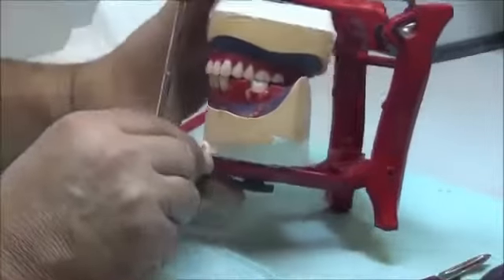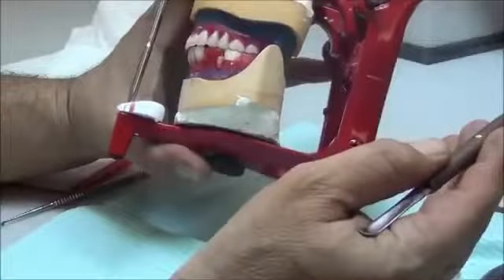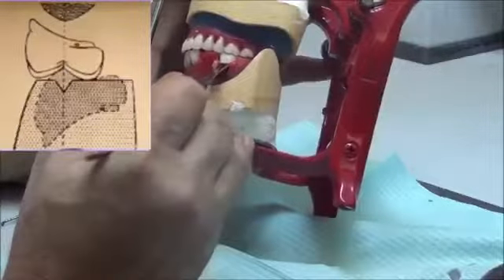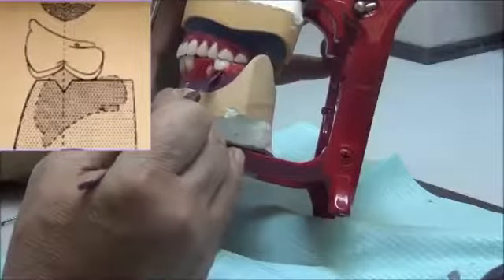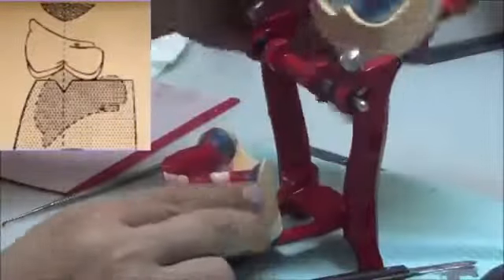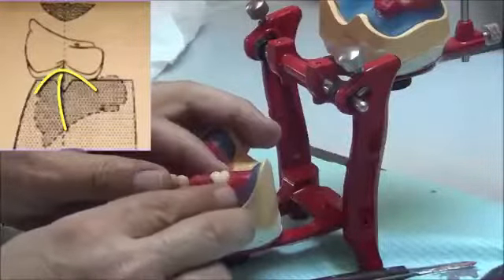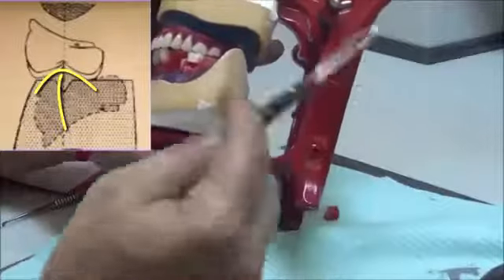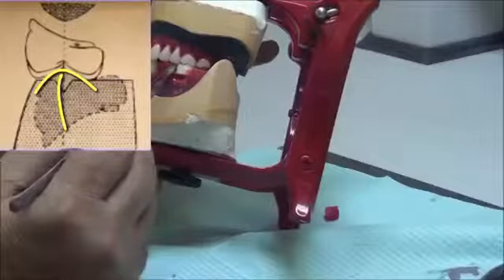We also want to point out that once you're working with the upper and then go to the lower, make sure your wax is totally cold. So what are we doing now? We are raising the tooth in location to increase the interdigitation between the cusps of the upper and the lower. Within its setting, you will find that on the mesial it's almost with the occlusal plane of the wax, but distally it's following the 6 going up. Why? Because we have the curve of Spee.